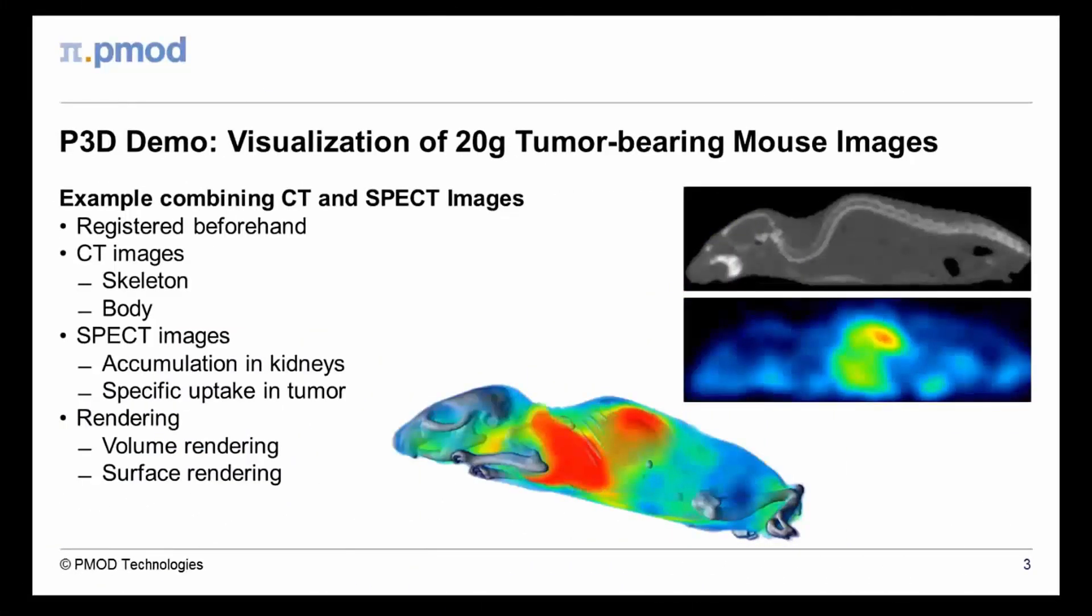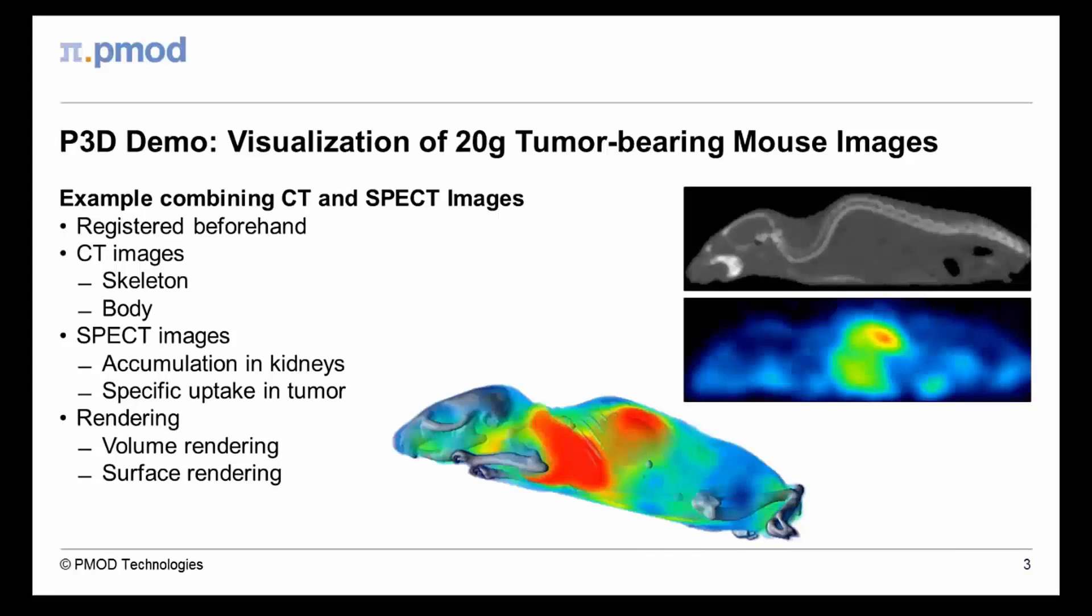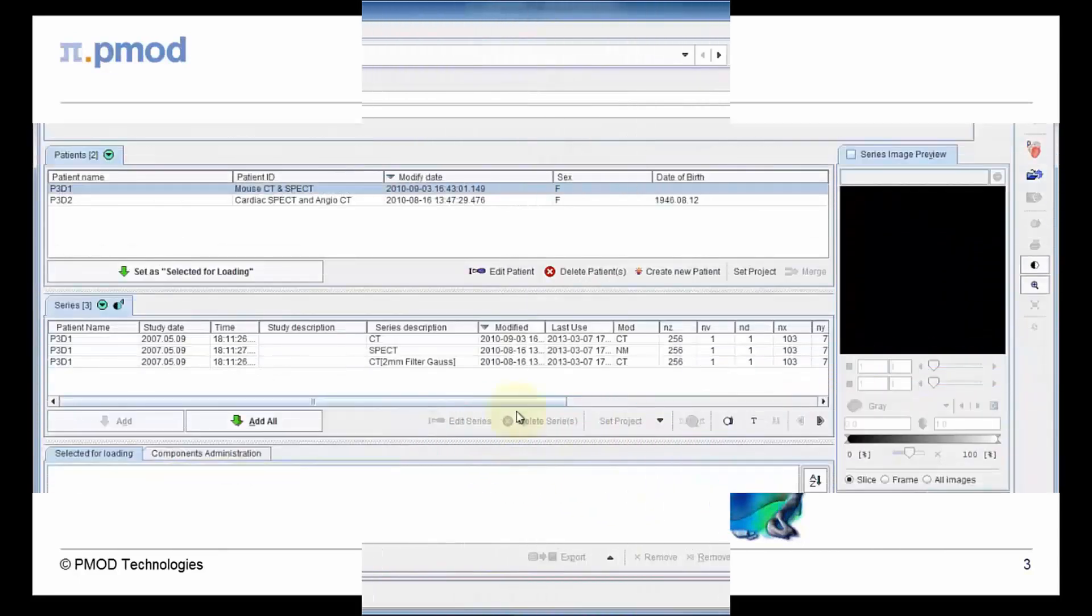The following 3 minute demo will provide a brief impression of our 3D image rendering tool. SPECT and CT images of a tumor-bearing mouse will be rendered. The CT data is used for visualization of the skeleton and soft tissue and is combined with rendering of SPECT tracer accumulation in the kidneys and tumor xenografts. Various volume and surface rendering techniques are applied to create meaningful 3D scenes.